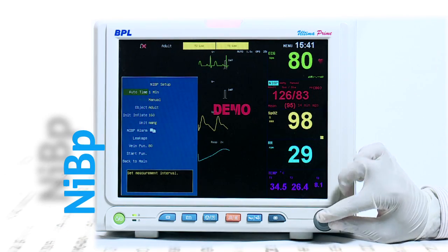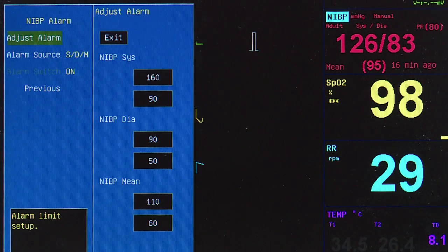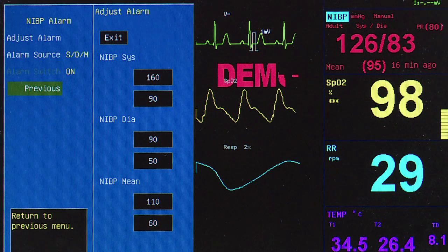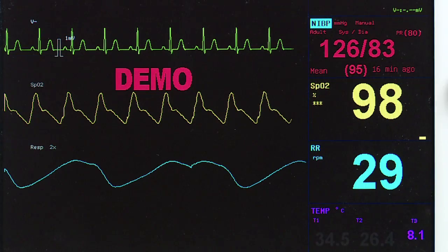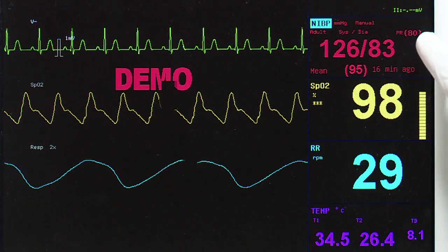NIBP is available as a standard option with different modes of monitoring: auto, turbo, and continuous modes of operation. The parameters displayed include systolic, diastolic, and mean arterial blood pressure values.